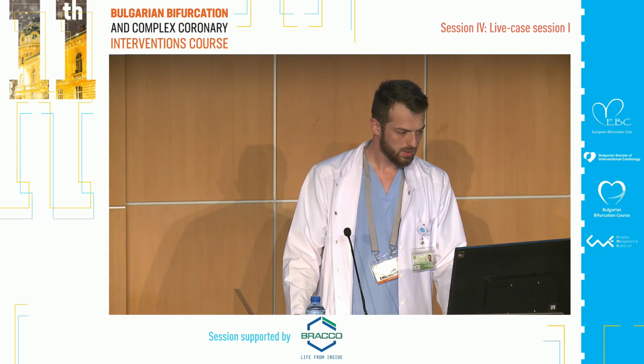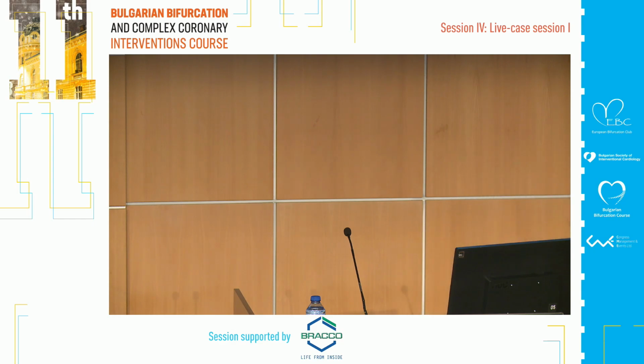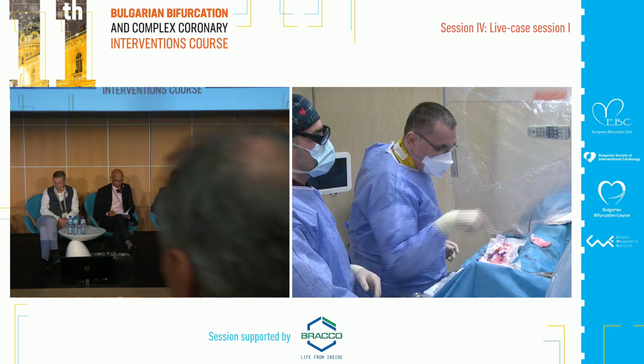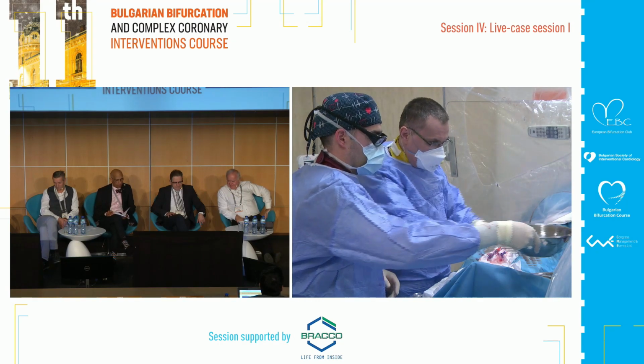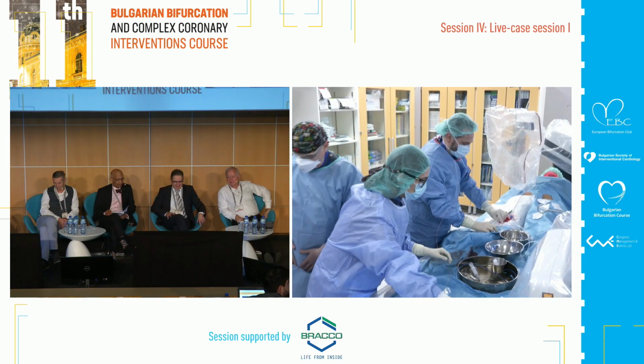Gianluca? Cath lab, are you hearing us? Valerie, Gianluca, how are you? Well, so we have seen the presentation of the case. Back to the first one.